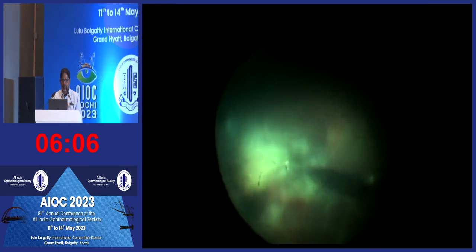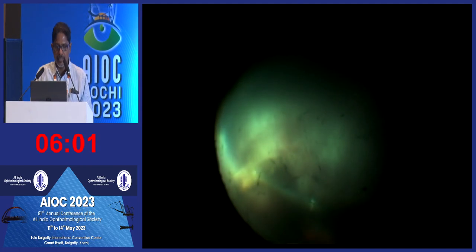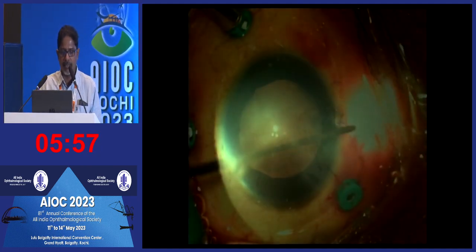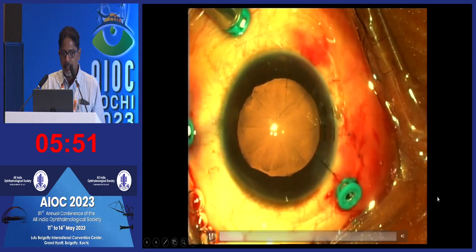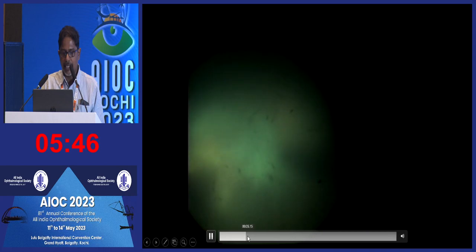You can see the vitrectomy in process, there's significant vitreous exudate, and you can see the stick there. It is incarcerated anteriorly in the sclera and posteriorly onto the retina. That's the site of entry where the suturing was done earlier. So it's a long and non-magnetic foreign body. That's the main issue here.